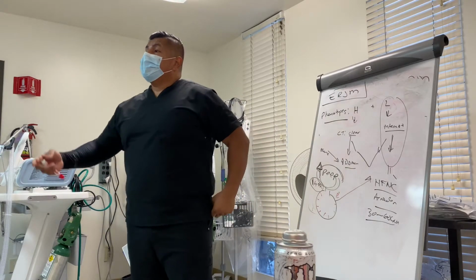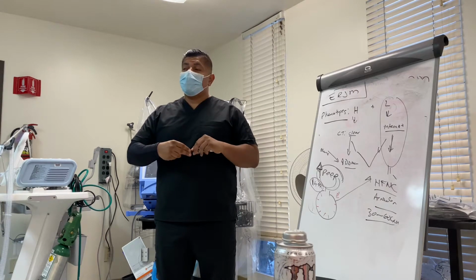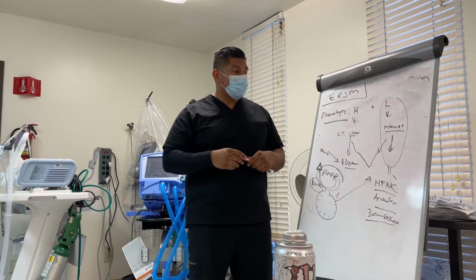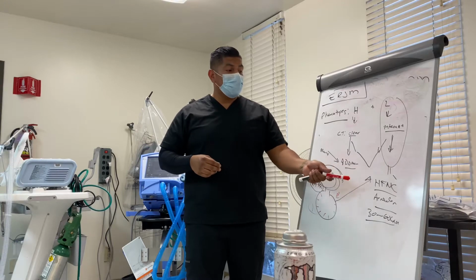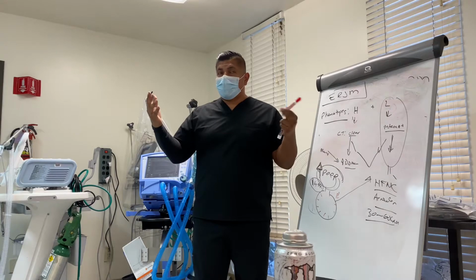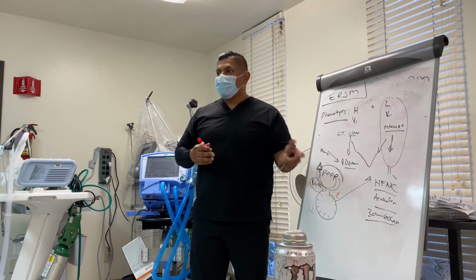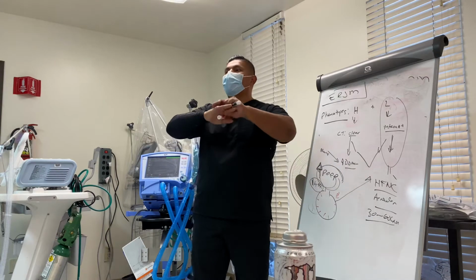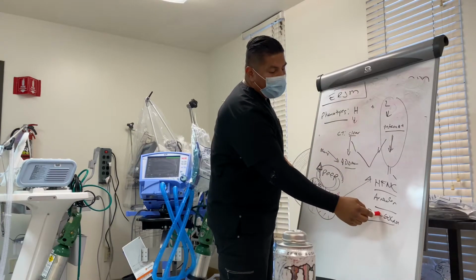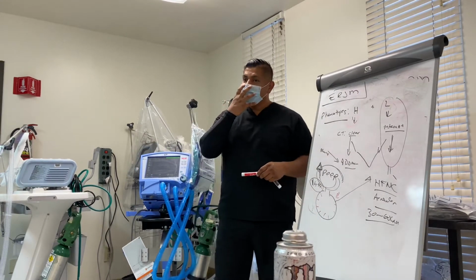But the thought is also to try to prevent any type of aggressive, unnecessary therapy on these patients. You want to start off with high flow. Some hospitals, like Good Sam, are topping off at 40 liters per minute because of that scare. Some people don't want to accept the studies, so we'll meet you in the middle at 40. We'll top off at 40, and if they don't tolerate that, then we'll add a non-rebreather on top of that as well.